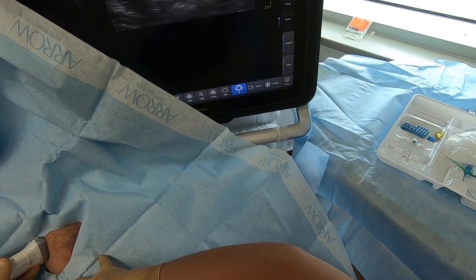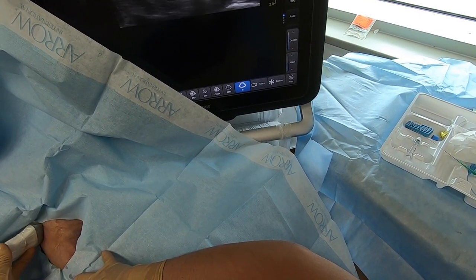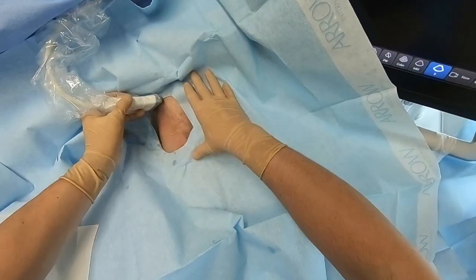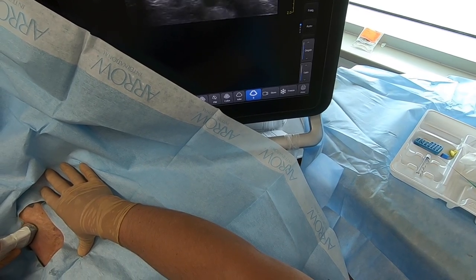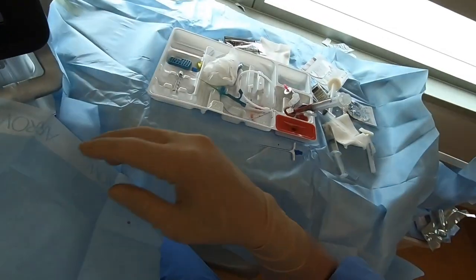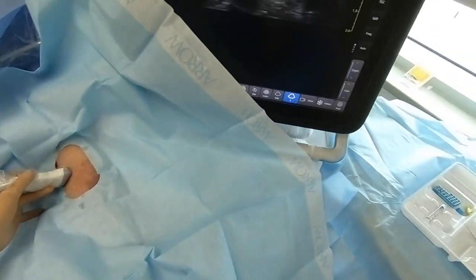Smaller devices are placed like an IV or like a radial A-line. They also vary in how sterilely they're placed. It's just a big IV and probably doesn't need to be sterile. This particular kit is a sterile kit, so we are placing it in a more or less sterile fashion.